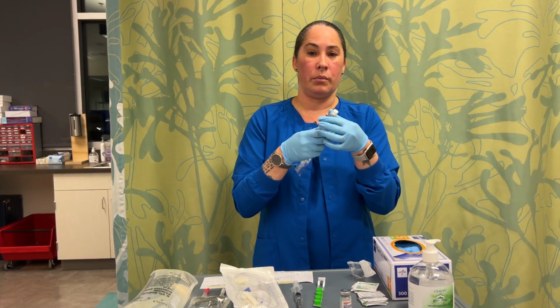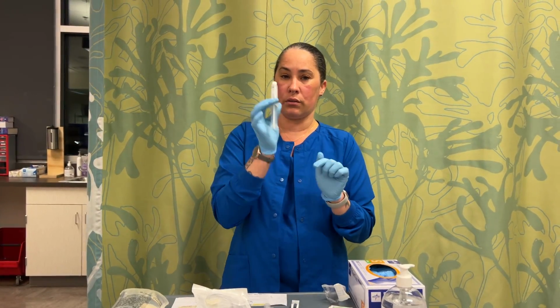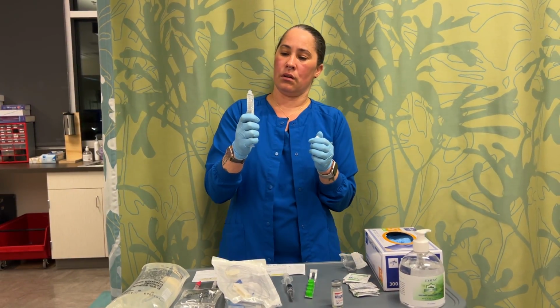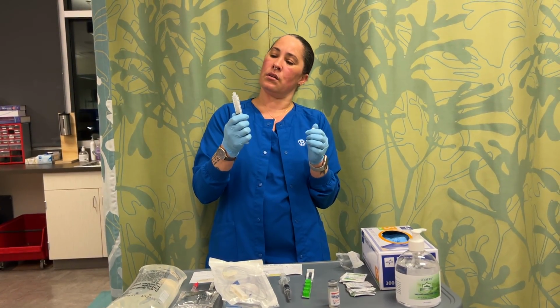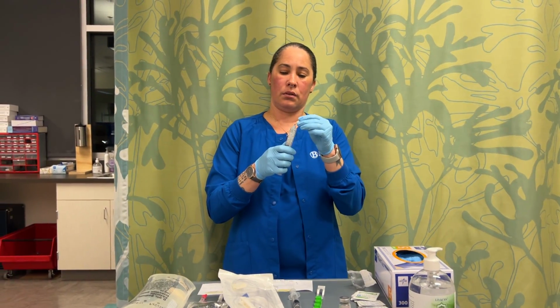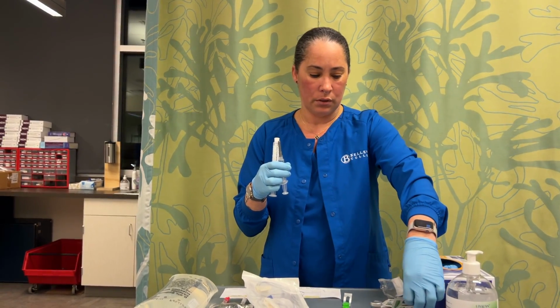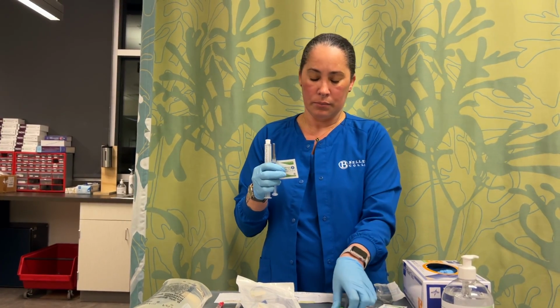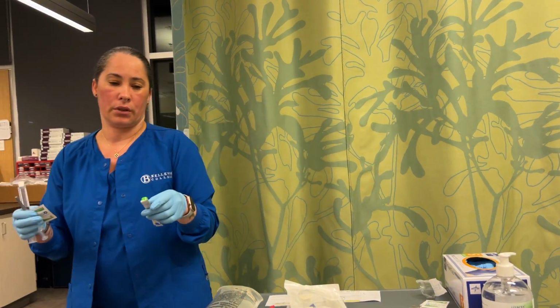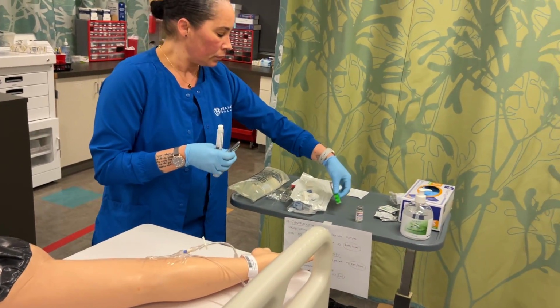Now these come with some air in them, so you're going to want to make sure you get the air out of them because, like I said, no bubbles here, no bubbles here. So you are going to open this and just make sure there's no air. Okay, so I'm going to grab my medication, and I am going to grab an alcohol pad, and I'm also going to grab one of these ports for the patient. So we're going to cover it until we move on to the next step, which will be our fluids.